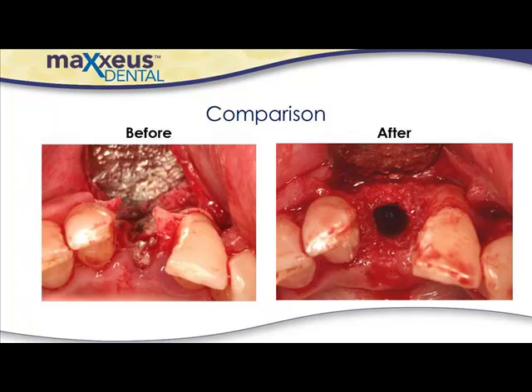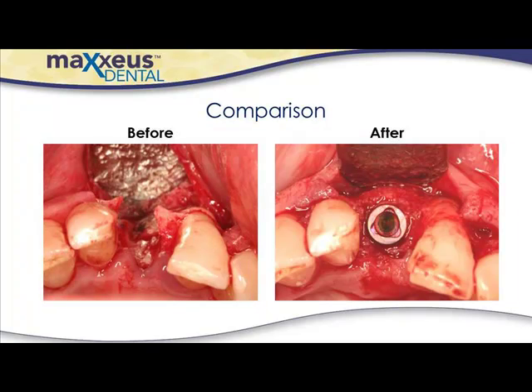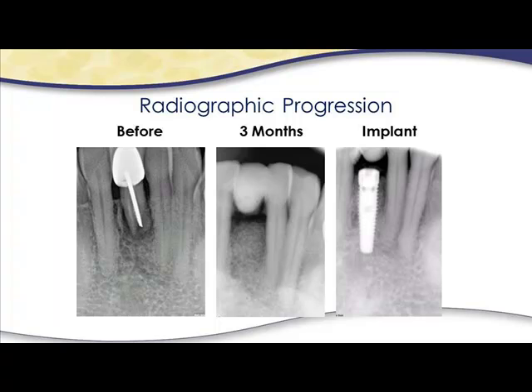This is an occlusal view of before and after comparison at implant osteotomy. On the screen is an occlusal view of the before and after view at implant placement. Shown here is the radiographic progression of healing. Without GBR, placement of a dental implant at this site would not have been possible.